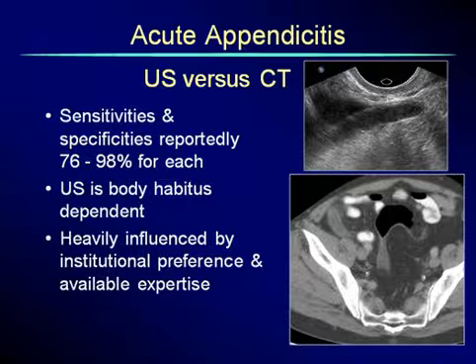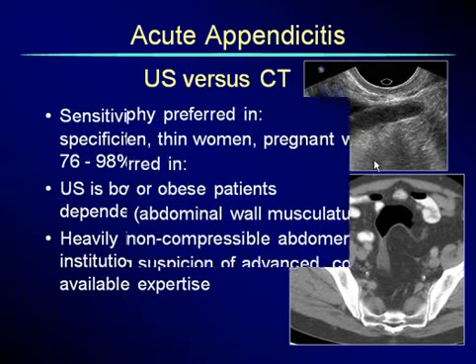Also, the choice between these two is heavily influenced by the institutional preference and the available expertise. So if your institution does not have people well experienced with ultrasound, they may feel uncomfortable. They'll send all these cases to CT. However, if you have a strong ultrasound section, they may offer to do the ultrasounds first. So that's often institutional preference.